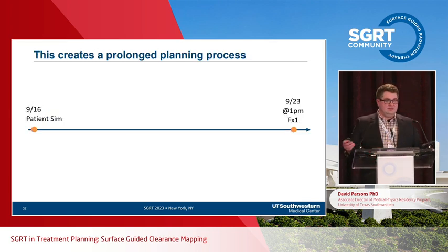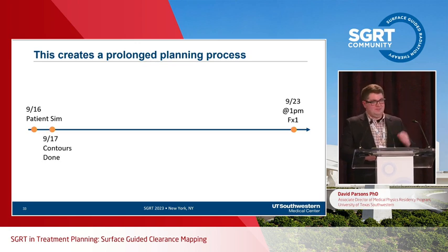So we can look at how this timeline unfolded for this patient. So back in September on the 16th, we simmed the patient in the afternoon. We're gonna treat them a week later on the 23rd at 1 p.m. MD was on their game, contours ready by the next day. So time to begin planning.